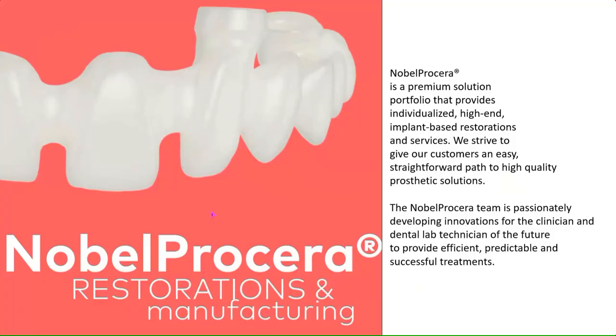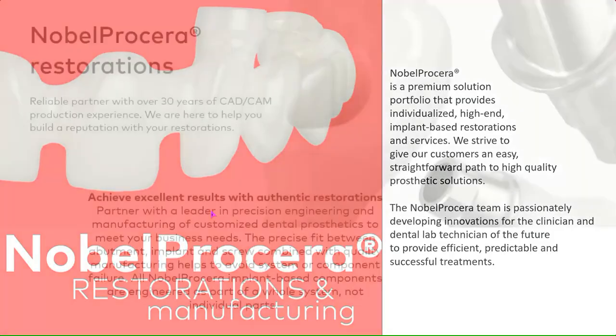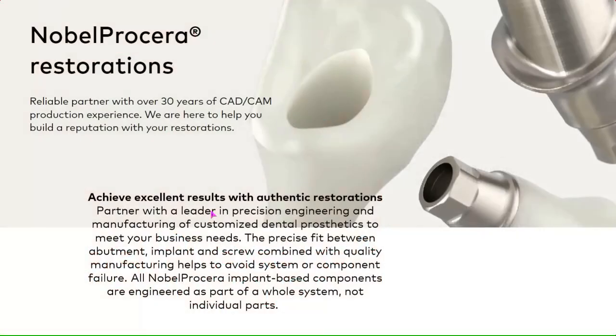But we're passionately developing new innovations, looking at new materials and new ways to design custom prosthetics for implant restorative dentistry, and always looking at ways to make this better. And with NobelProcera, we have over 30 years of experience in CAD/CAM, really starting this industry many, many years ago when we were dealing with just straight substructures at that time.